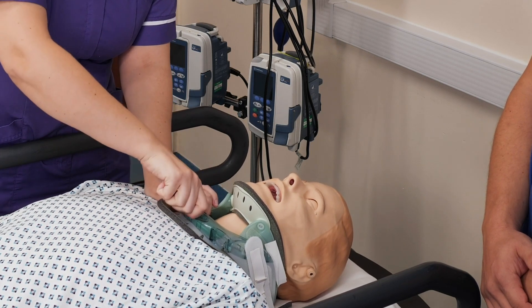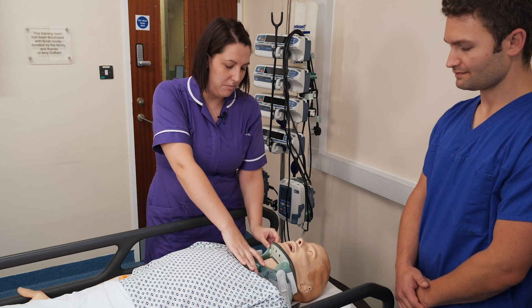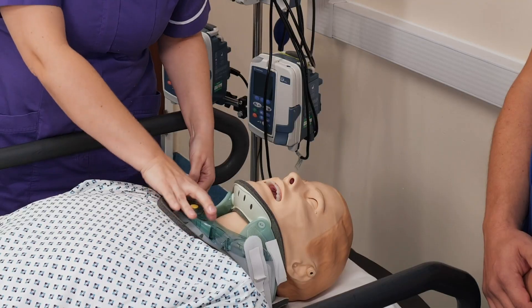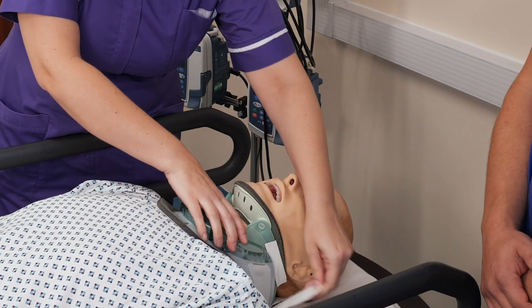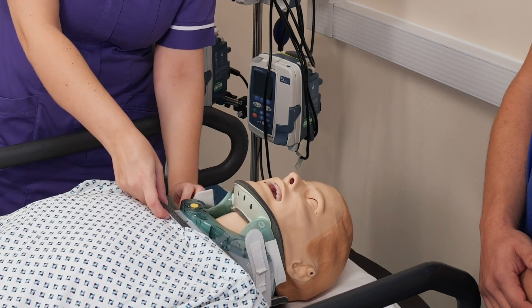Just loosely tighten the straps and then adjust the collar to your patient's height. The collars do fit quite tight — they need to fit tight — but you just need to make sure that they're not so tight that they're going to be digging in. Then tighten your straps fully.